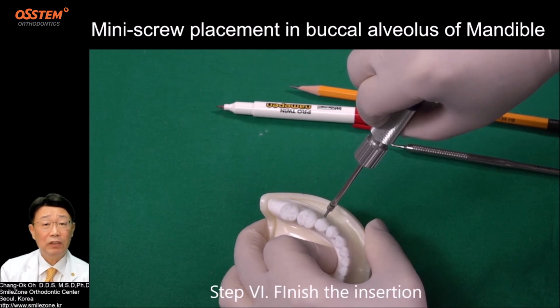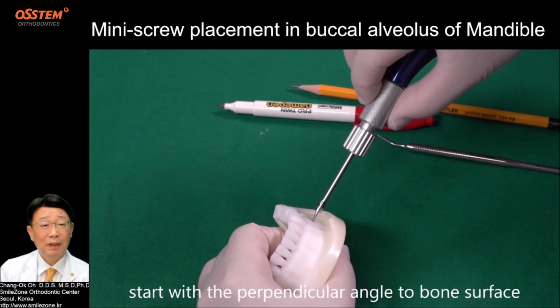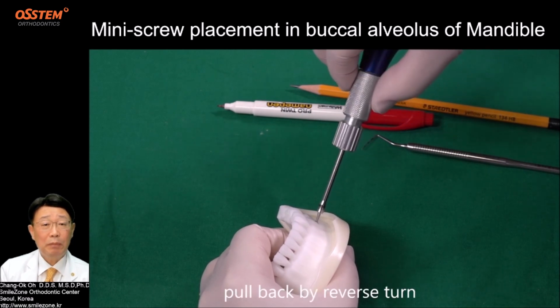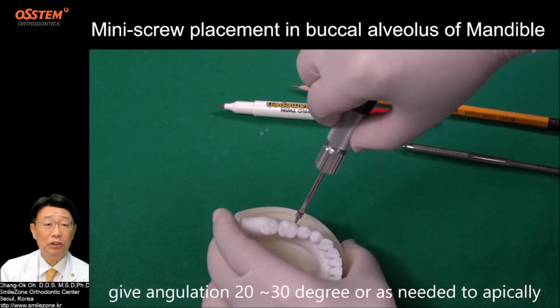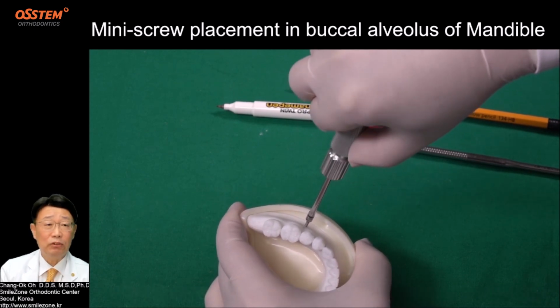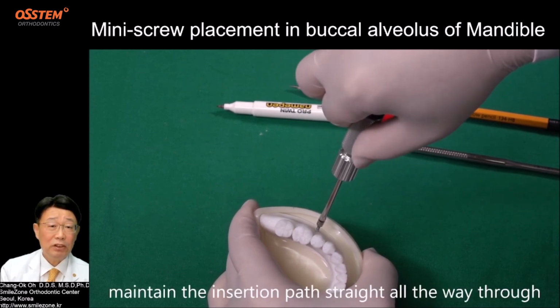Step 6. Finish the insertion. Turn the driver clockwise to finish the insertion. Start with a perpendicular angle to bone surface. Pull back by reverse turn to prevent breaking the tip of the screw. Change the path of insertion. Give angulation 20 to 30 degrees or as needed to apically, then turn clockwise to finish the insertion. Maintain the insertion path straight all the way through.